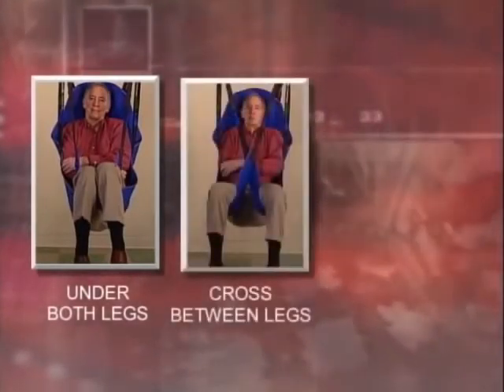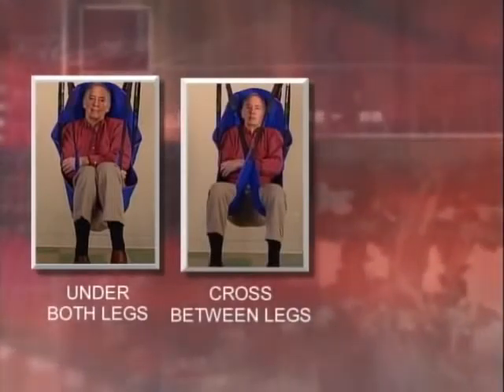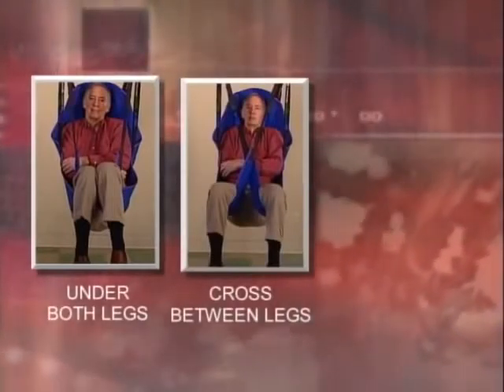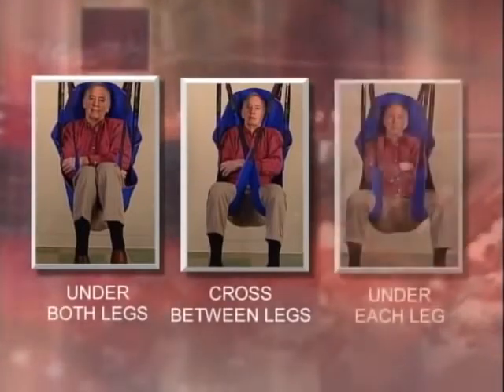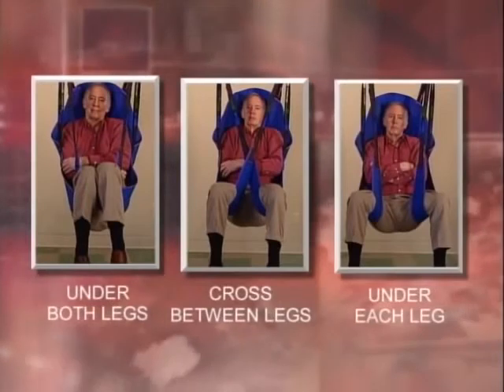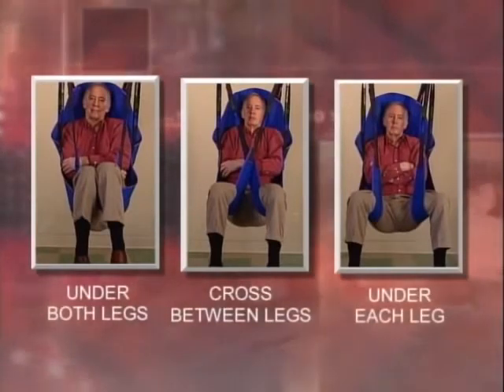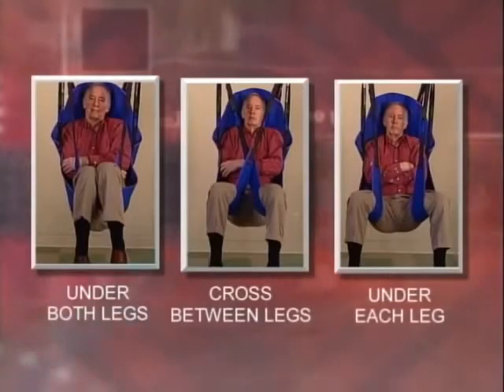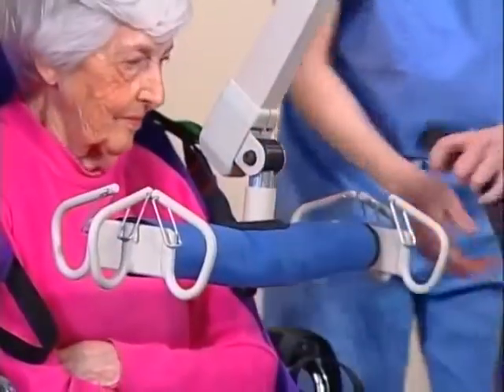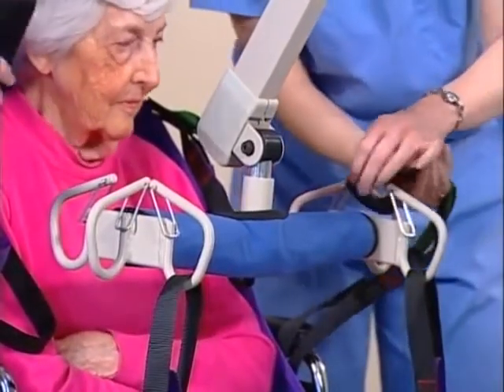You can attach them so they cross between the resident's legs. This technique draws the resident's legs together. Or you can attach them so they go under the resident's legs directly to the swivel bar. This technique separates the resident's legs for hygiene tasks. Just make sure that you use the same color straps for both legs.